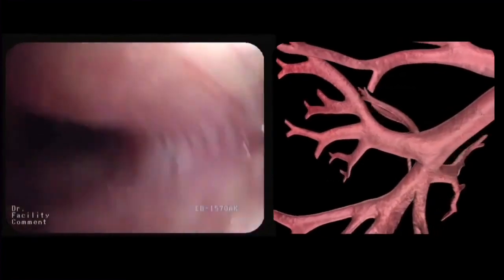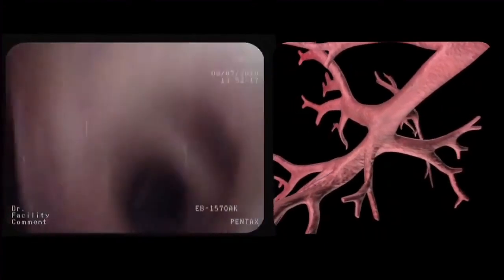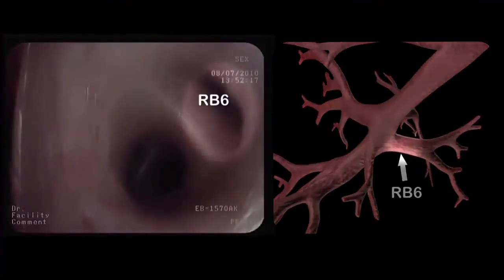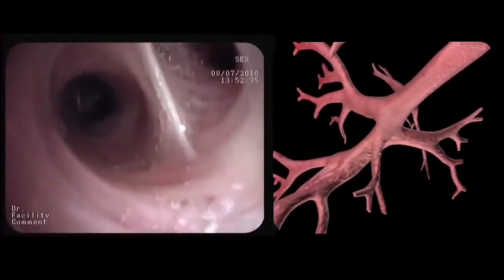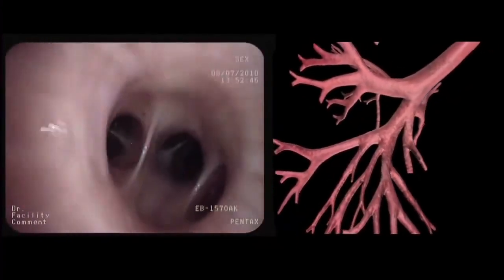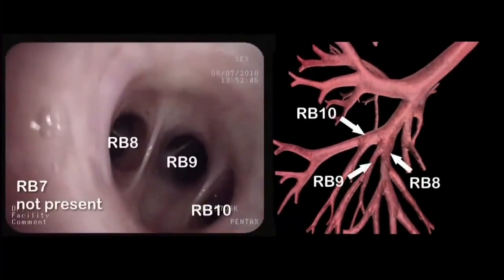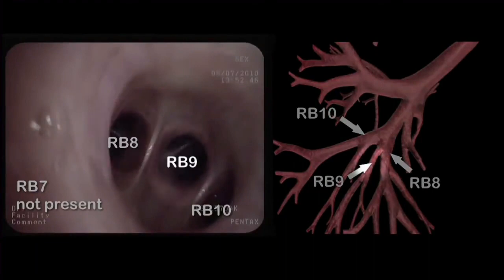After going back to the intermediate bronchus, we identify and enter the apical segment of the lower lobe or RB6. When we extend further down the lower lobe, we reach the basal branches: the anterior basal branch or RB8, the lateral basal branch or RB9, and the posterior basal branch or RB10.